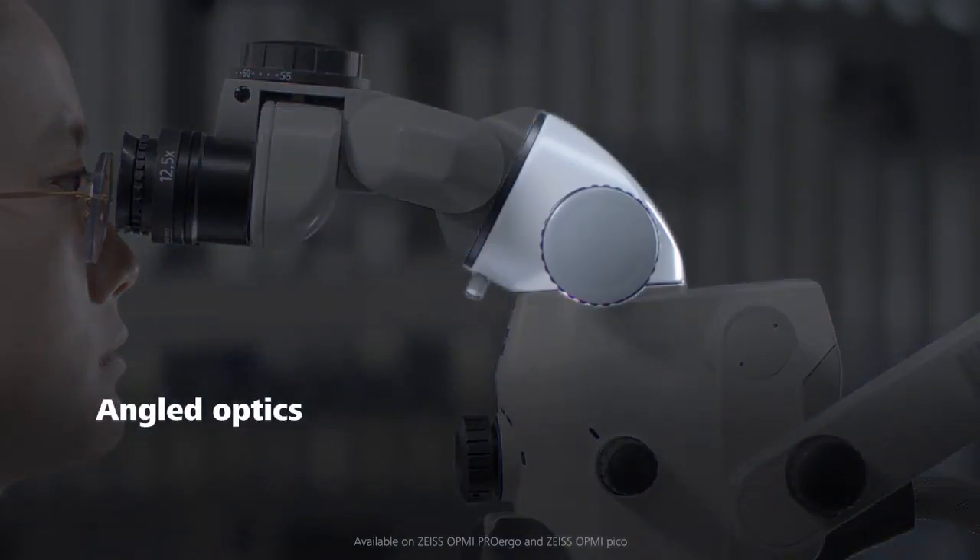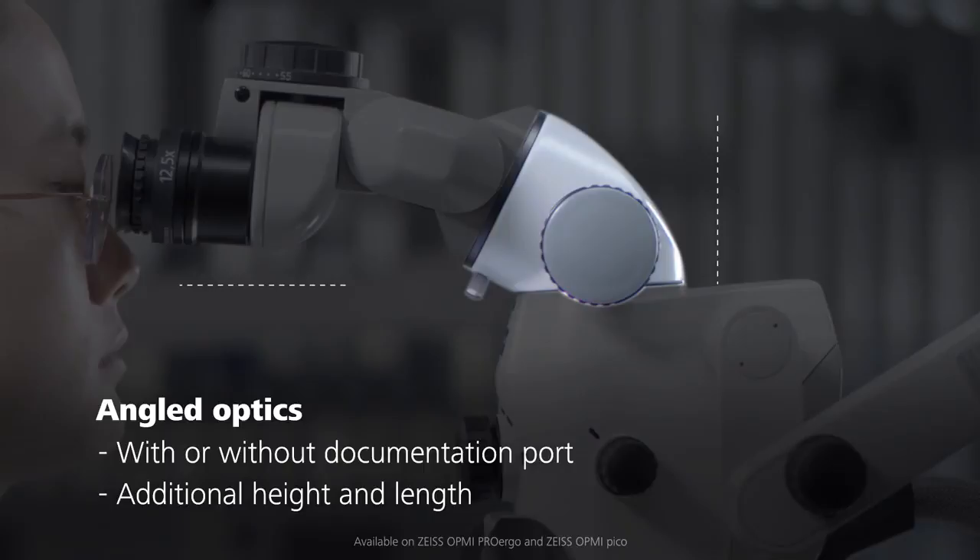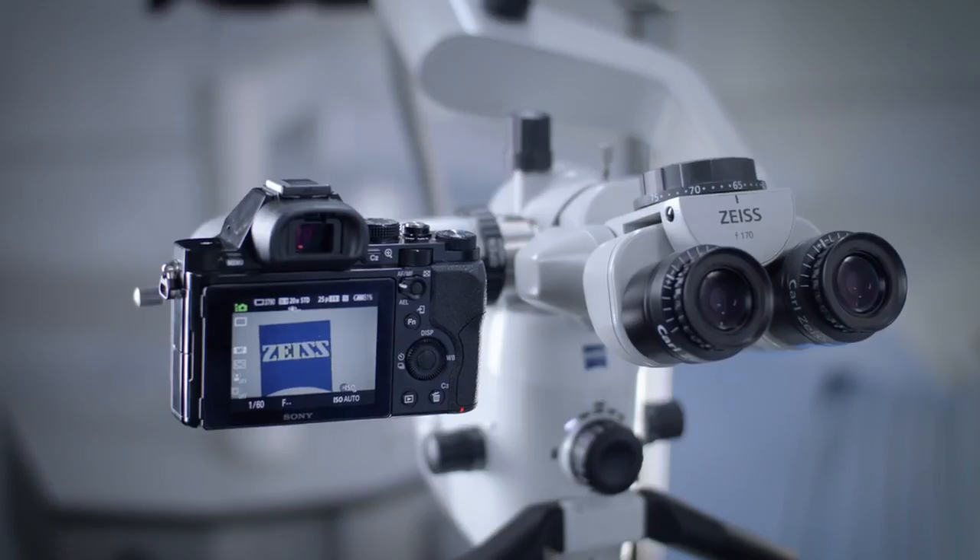The angled optics are available with or without documentation ports and provide both additional height and distance between you and your microscope. An external camera can be attached to the documentation port.